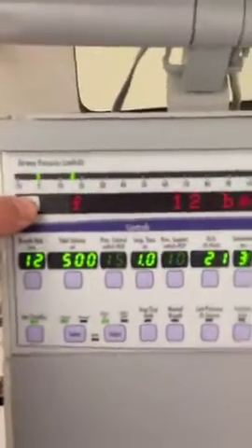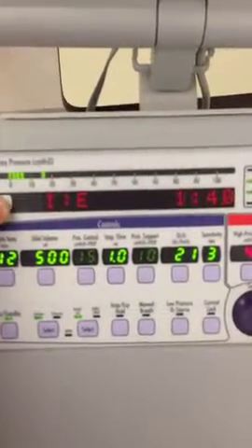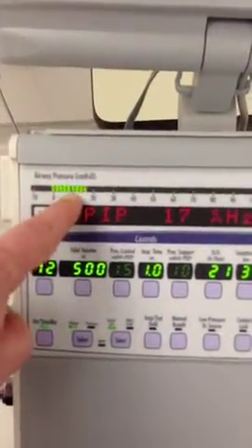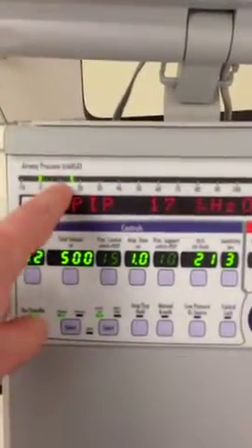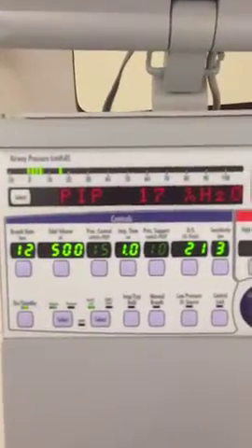I can expedite this cycling process and choose different ones by hitting select, as I'm doing right now. But nice feature, especially when you're looking at a patient through a window, let's say in a CT scanner, and you're not actually in the room. Just look at that LED, and you can hopefully identify where that's coming up to and identifying your peak pressure.